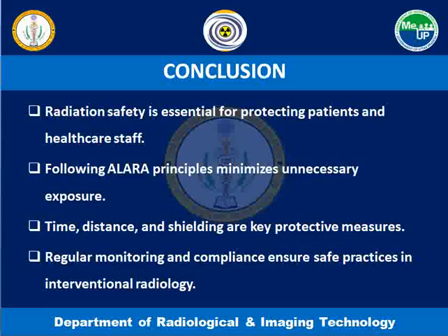In last, we come to the conclusion. Radiation safety is essential for protecting patients and healthcare staff. Following ALARA principles minimizes unnecessary exposure. Time, distance, and shielding are key protective measures. Regular monitoring and compliance ensure safe practices in interventional radiology.